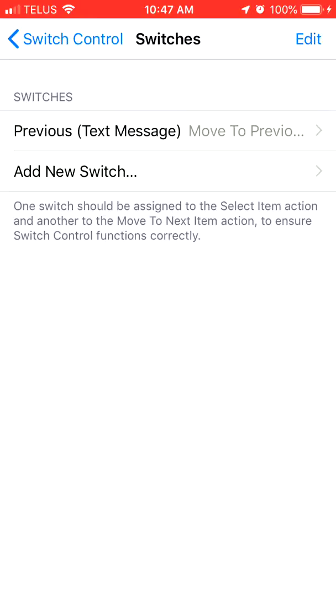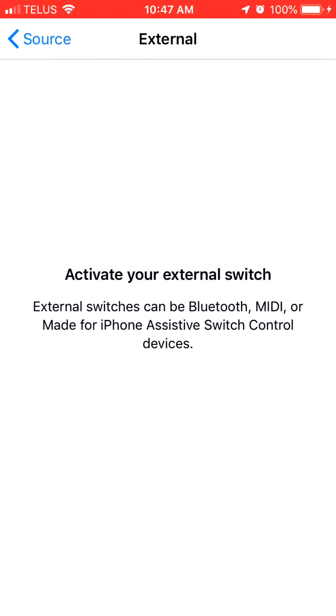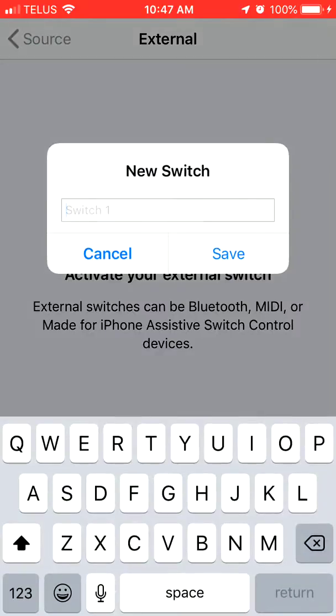So now I can press back, and now I have an option to exit switch control or add a new switch. As we have 5 switches to add, we will be adding a new switch. So the next switch we need to add, click Add New Switch, External again. We're going to press down on the switch in the upper right hand corner of the control panel on the VISAIDE Smart Cane 5000. So I've pressed that switch.